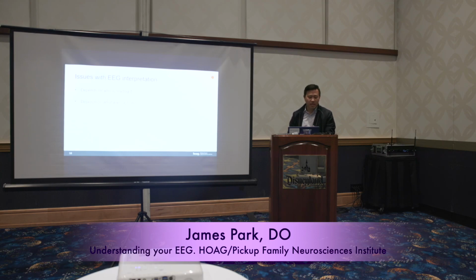So the main issue with EEG interpretation again depends on who's reading it. What's the doctor's experience with it, right? Have they seen these things before? Do they know that they're normal variants versus abnormal, for instance? And then it also depends on what's captured.